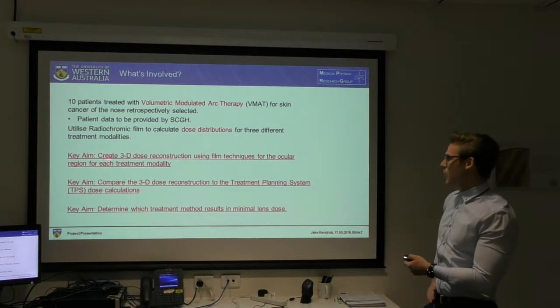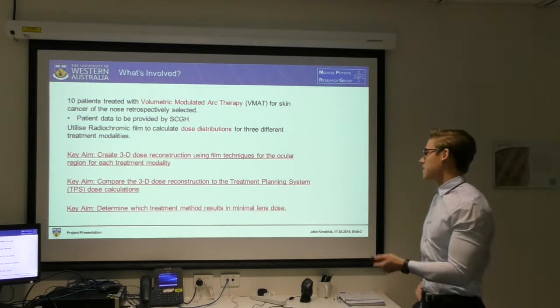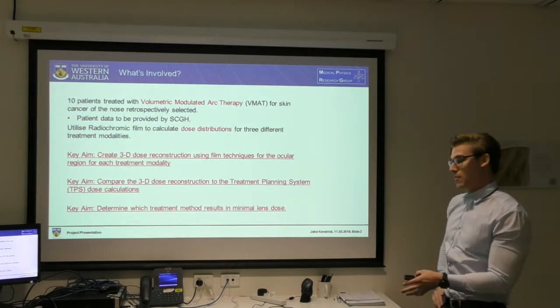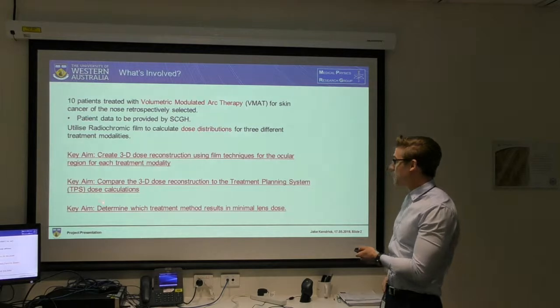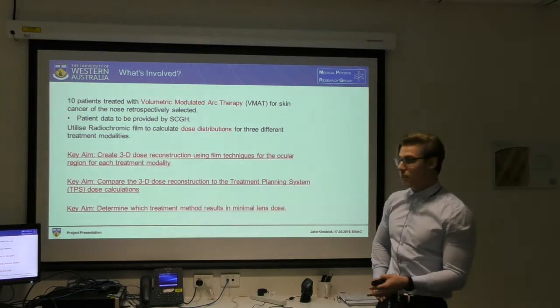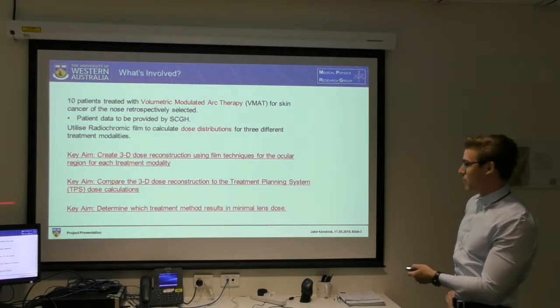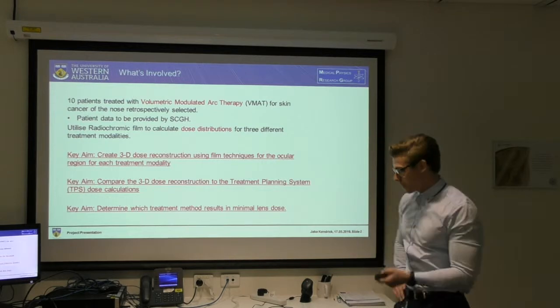The first one being to create a 3D dose reconstruction using film techniques for the ocular region for each of the treatment modalities. Secondly, to compare that 3D dose reconstruction to the treatment planning system dose calculations and see how they match up. And finally, if I can, determine which method results in the minimal lens dose.